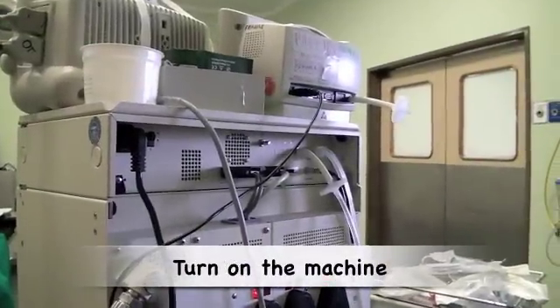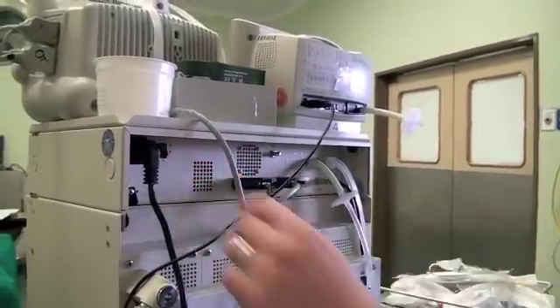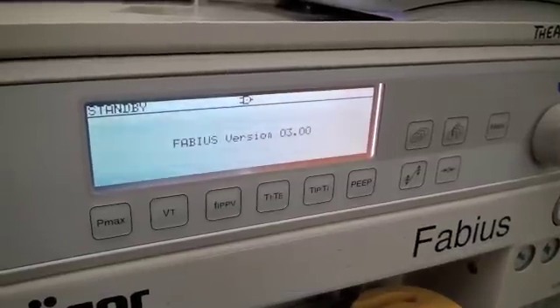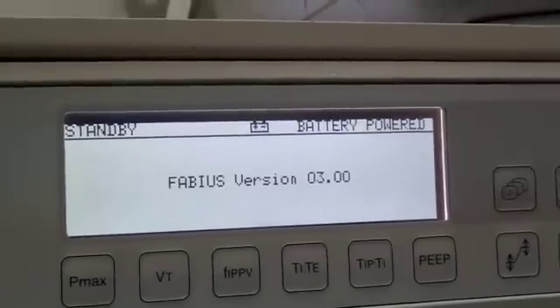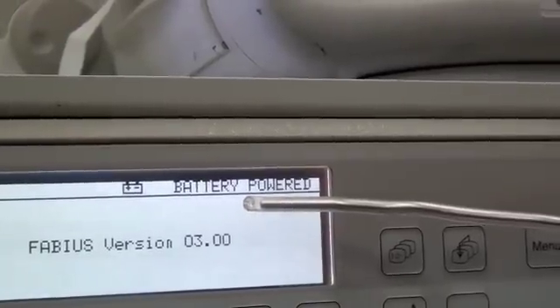Next, one needs to turn on the machine. Some anaesthetic machines have a main switch at the back of the machine, while the switch on the front puts the machine into standby mode. The machine is indicating that it is powered by the main supply. It is also important to check that the machine's battery is fully charged and functional. This can be done by turning off the main power source to the machine.